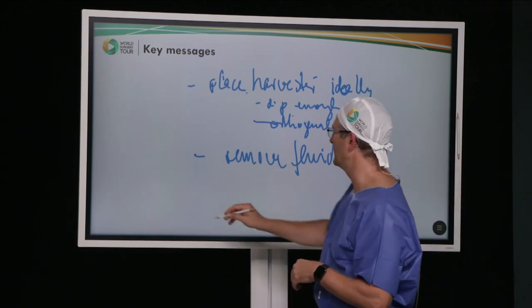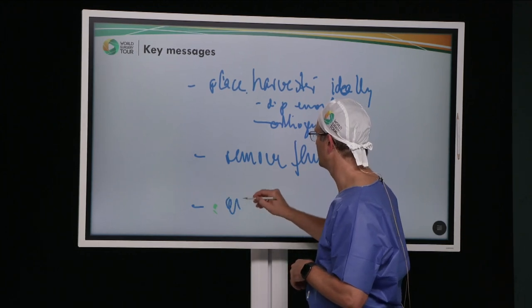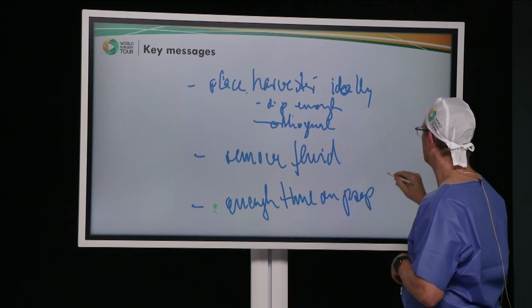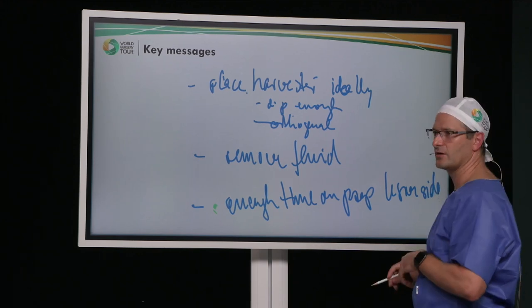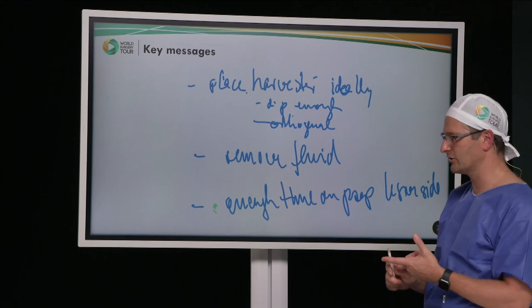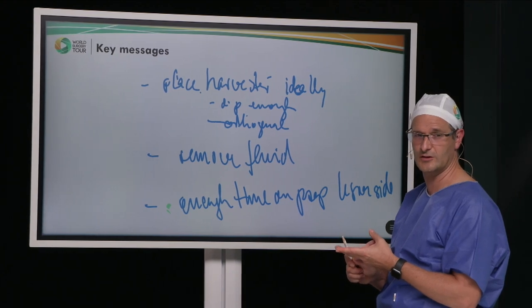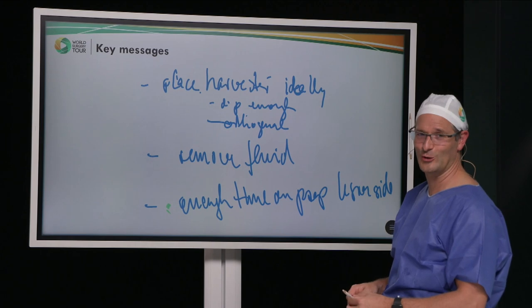And lastly, I did it in the beginning, spend enough time on prepping the lesion site so that when you move in and out, you have an unobstructed view. In terms of the technology, AMIC has been proven. I like the idea of combining it with a minced cartilage procedure, single step. Now we just wait what our results are going to show.